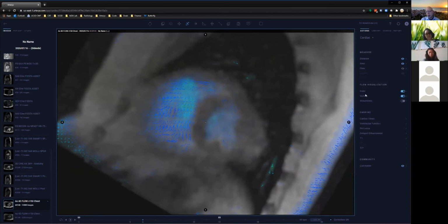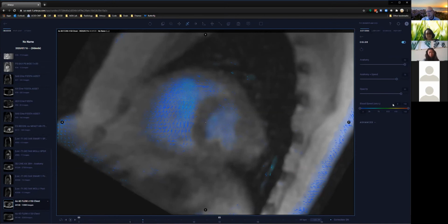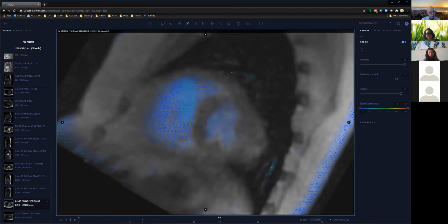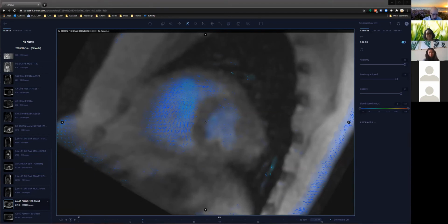what that gradient is, the LV pressure may be what, systolic at 120, right? And the RV, even with pulmonary hypertension, 50, right? So a gradient of at least 70 is what you're going to be expecting. So there's going to be high velocity of flow across it. What is modified Bernoulli? So let me try to bring up my calculator here.